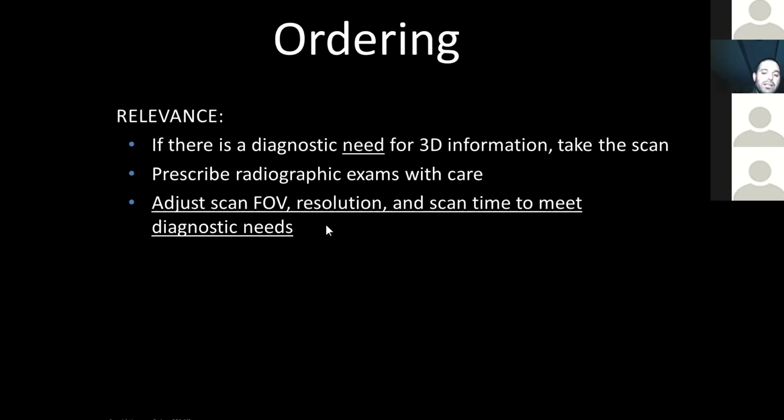Compare that to the adult patient in pain who you are suspicious of an endodontic problem where you need as much detail as you can to find a suspected missed canal or fracture. That patient, you are justified in getting as high image quality as you can using as much dose as the machine will let you to do it.